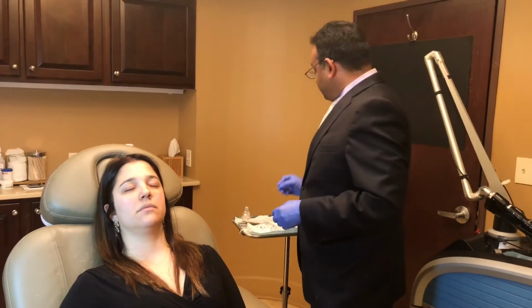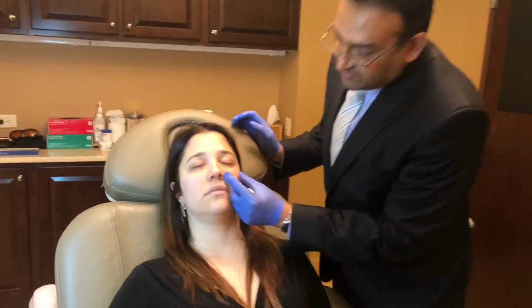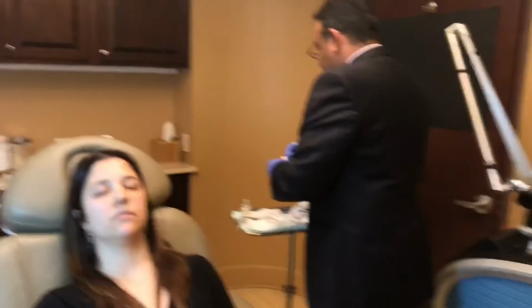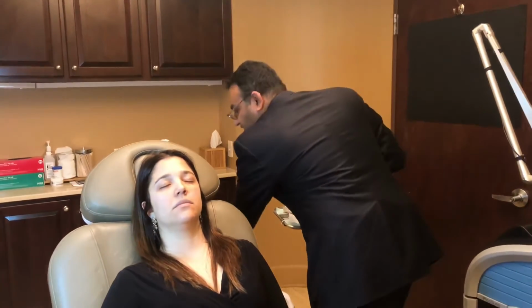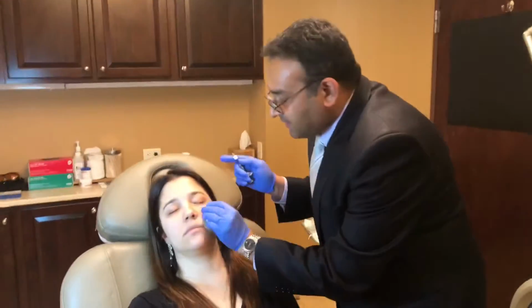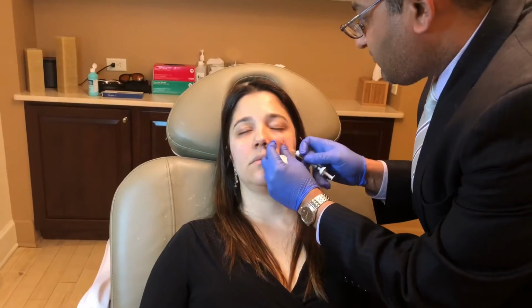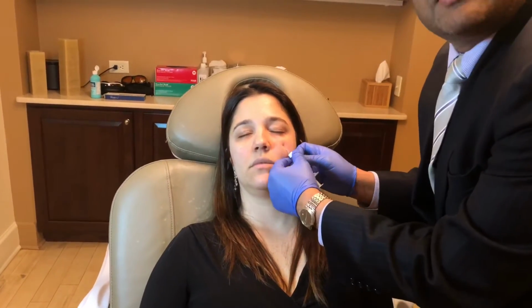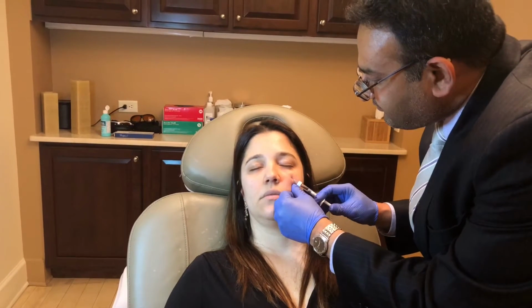And again, as you can see, because our lidocaine had epinephrine in it, there's actually no bleeding. Sometimes I have to squeeze it a little bit just to see a drop of blood, so I know where to go in. Otherwise it becomes difficult for me to determine where we're going in. So again, we're going to be doing the same thing. I'm going to be going in through this tiny hole right here, and a little bit of pressure, and that's it. We're actually in, and you can actually see the tip.